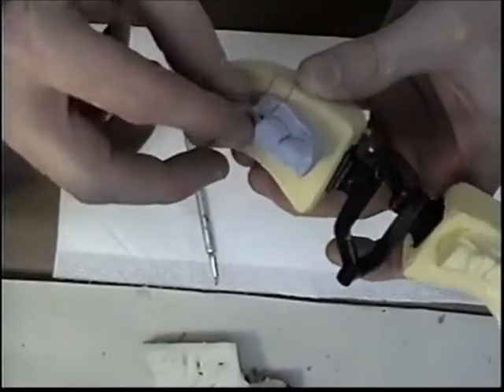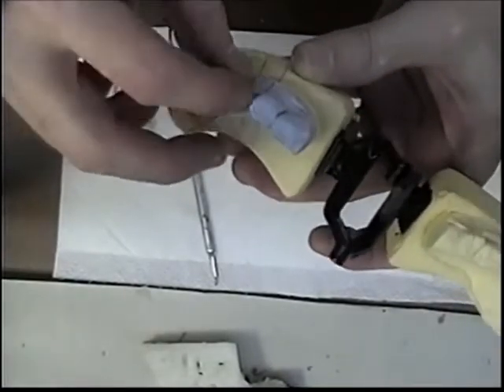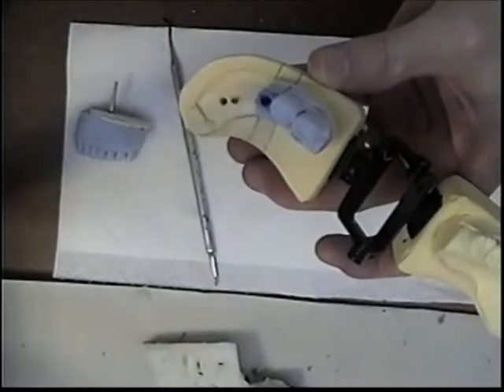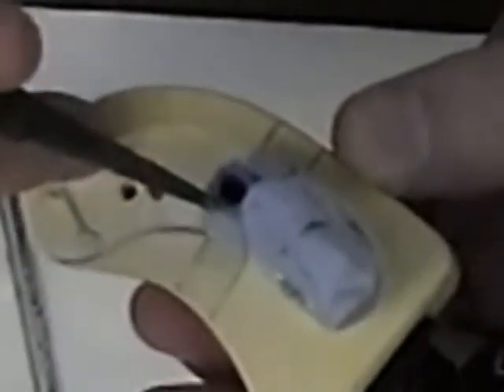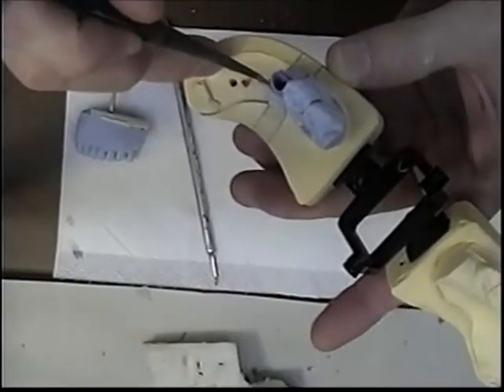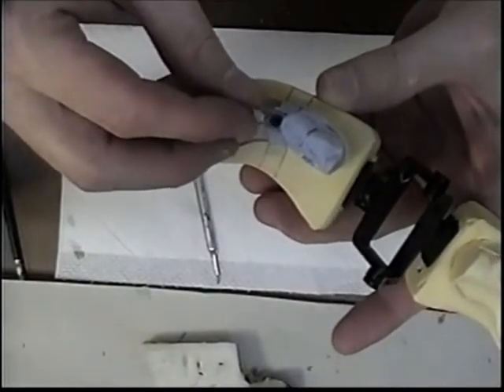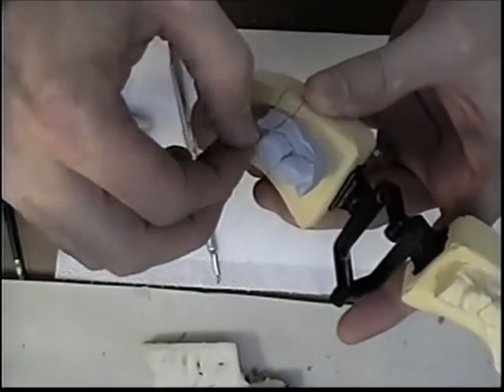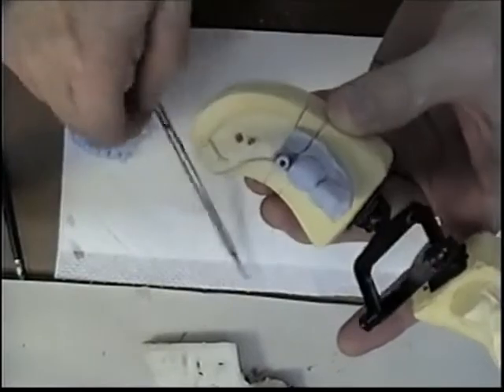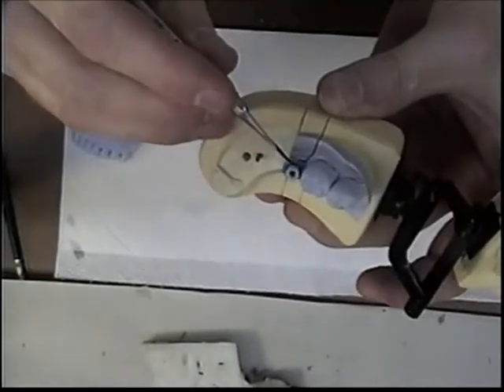I'm going to lubricate this soft tissue area so that my wax does not stick to the tissue area. Now I'm going to want to flow my wax just inside the tissue area here.